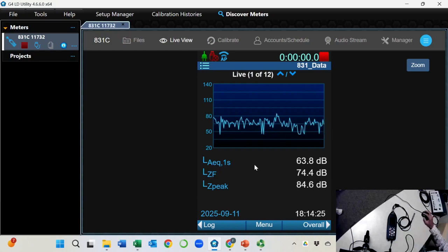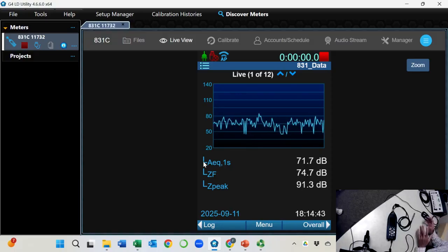You can see there are 3 numbers here. L stands for intensity level. Again, this lab is so you have some experience for the calibration. Hopefully, it will help you to digest the content when you watch the videos for topic 3.